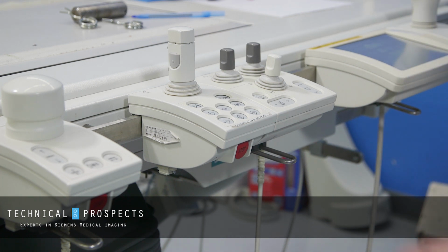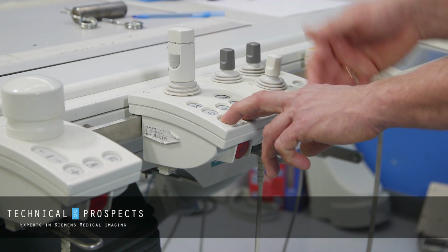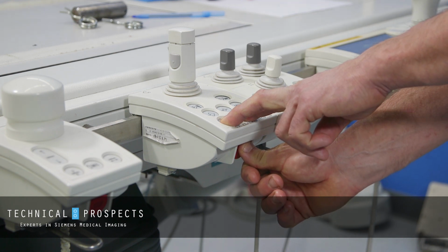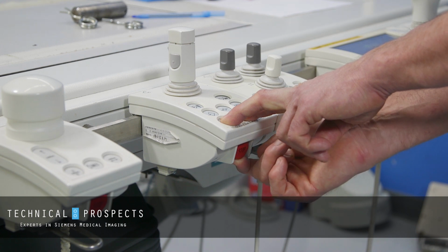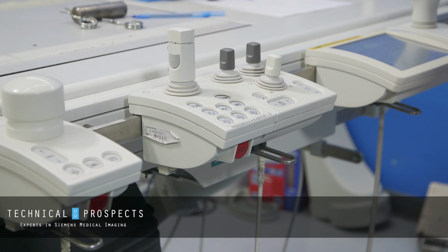The quick reset of the stand control module and the whole RTC and RTIS NGO system can be performed by simply pressing program 1 and program 2 in the stand control module and pressing the emergency button underneath. You hear some clicks happening, you release the emergency switch, remove your fingers from program 1 and program 2, and after 10-15 seconds you will hear the brakes coming back, and that means the system is ready for normal operation again.